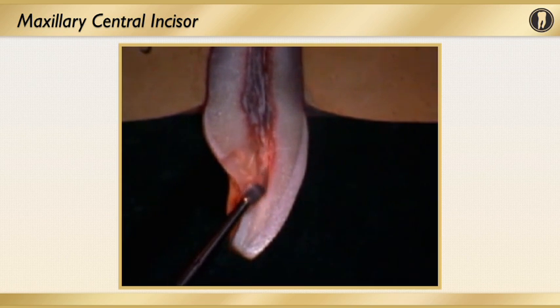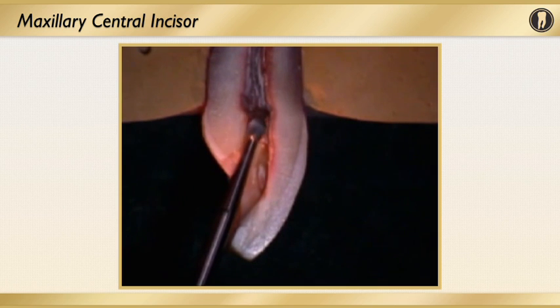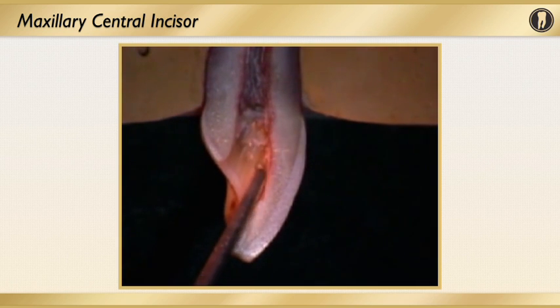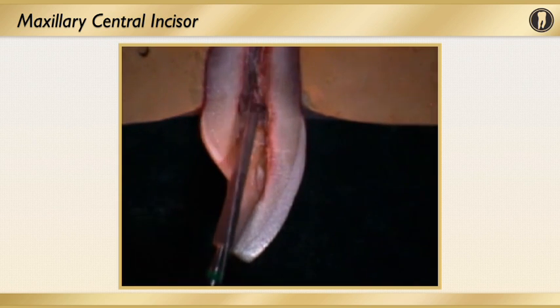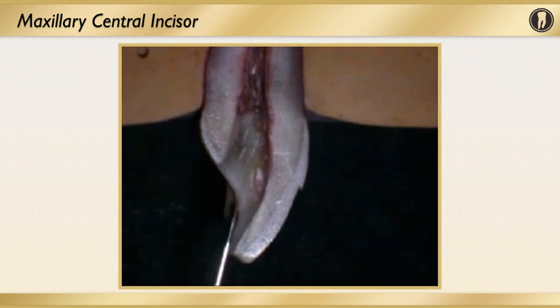They're going to now go to the refinement stage, and I like to use a thin diamond in the refinement stage, and really you want to refine this lingual triangle to get your straight line access. Here's the long thin diamond, and they're refining that lingual part right there, and that'll give you straight line access. The biggest thing I see is that lingual triangle. Here's the DG16 showing you the straight line access.